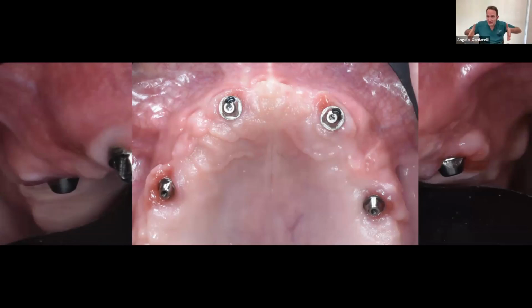Can you see that we have this grow above the soft tissue? This is important for a long-term survival. That's why using this multi-unit abutment, I think in this kind of rehabilitation, we can increase our success in terms of the soft tissue healing. Okay?